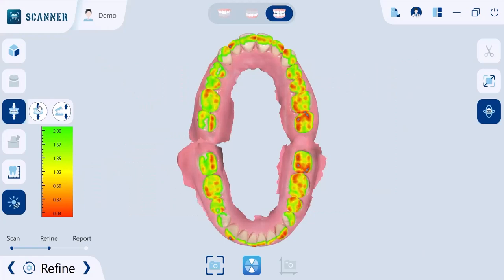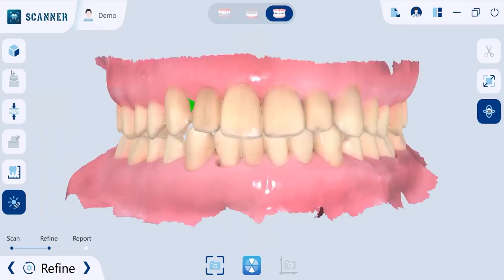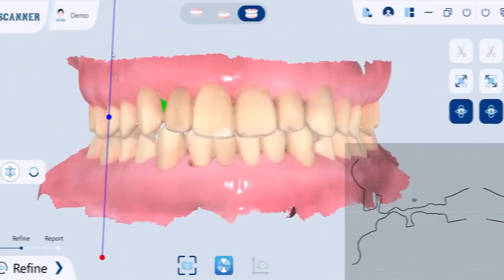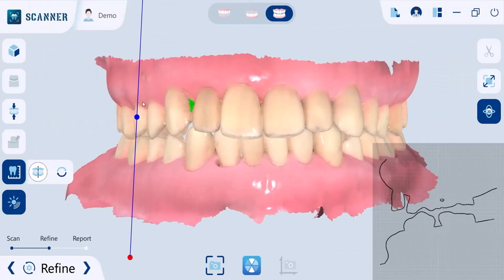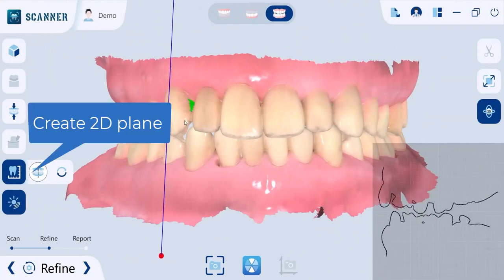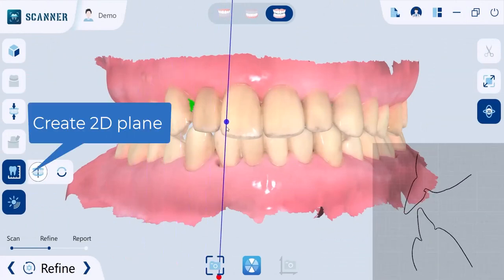If you acquire occlusal contacts using an articulating paper, you can compare the digitized occlusion analysis and the articulating paper. To take measurements, generate cross-sections to check the 2D outline of the models and take accurate measurements.